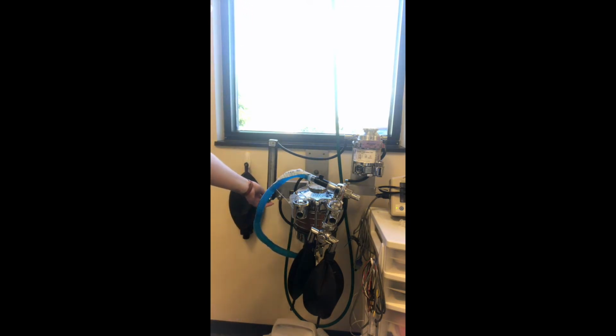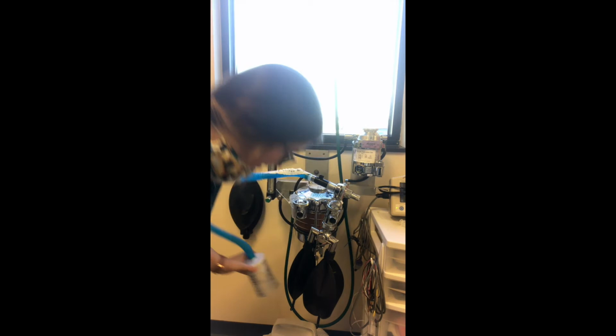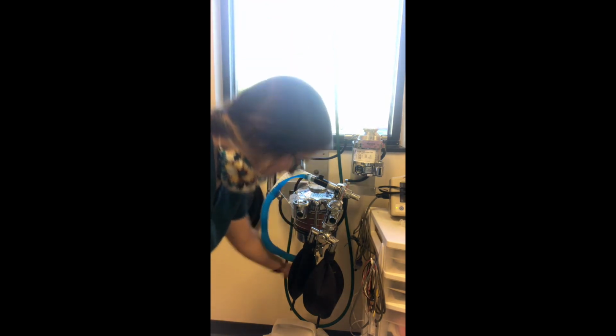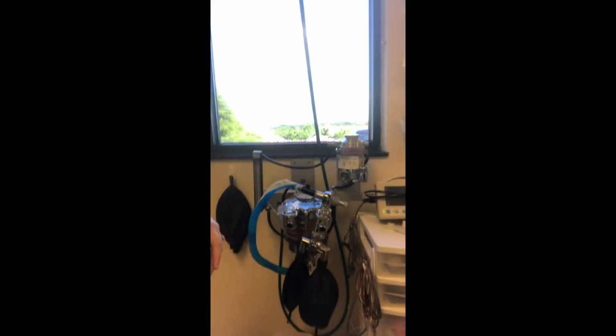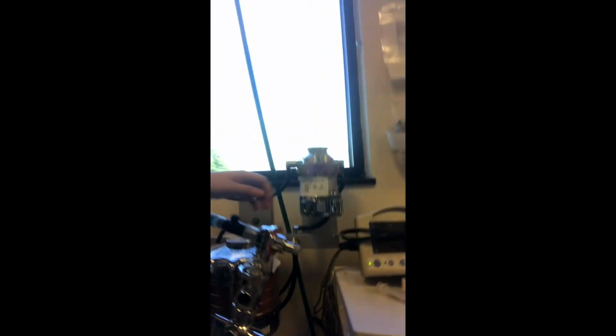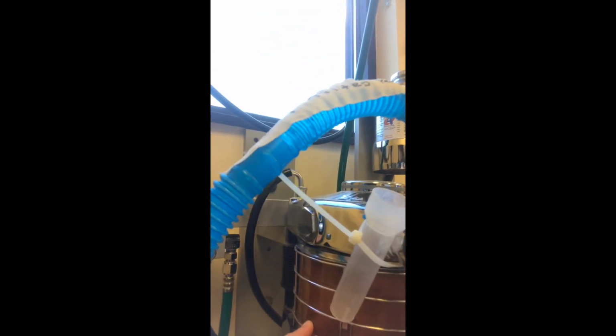We have our O2 over here. Our scavenging system is our F-air. Our O2 comes from tanks that are in a separate area. Then we have our CO2 absorbing pellets.